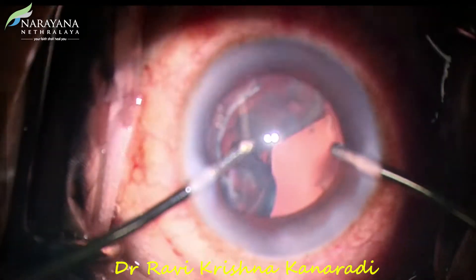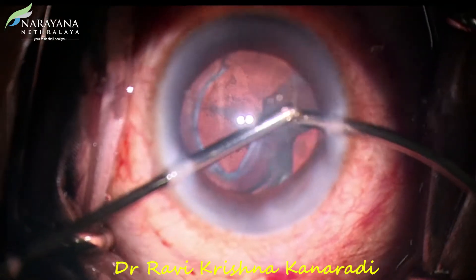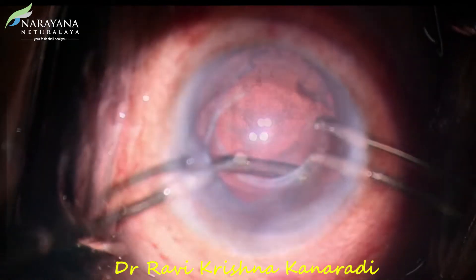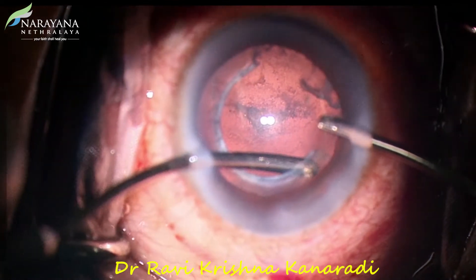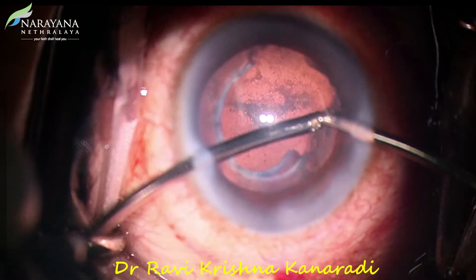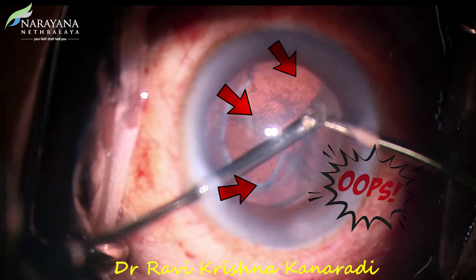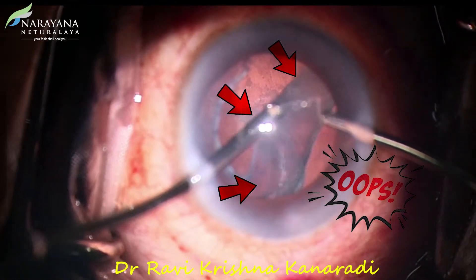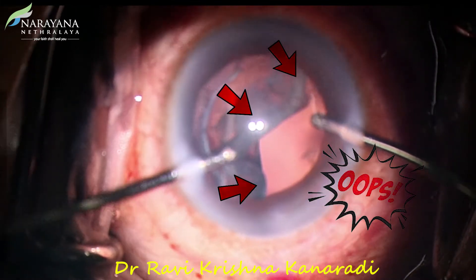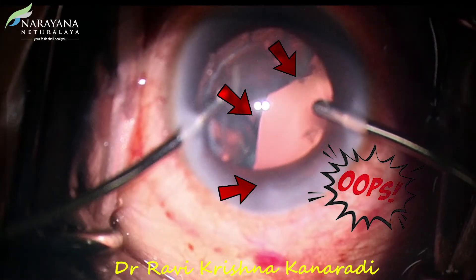By mistake, I pulled the capsular margin with the epinucleus at around 7 o'clock position, which caused zonular dialysis between 4 to 9 o'clock position. This is a slow-motion video. I could have avoided this by doing a proper hydrodissection after the removal of the nucleus.